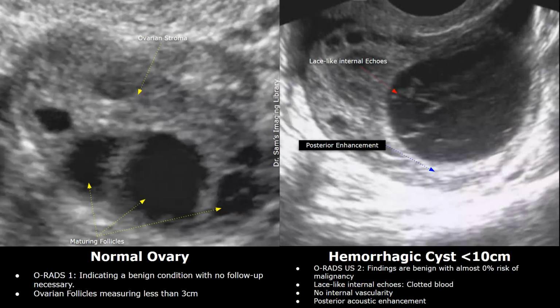A hemorrhagic cyst measuring less than 10 centimeters will fall under O-RADS US 2. A hemorrhagic cyst has lace-like internal echoes. These reticular internal echoes are seen within a hemorrhagic cyst. These are due to clotted blood. No internal vascularity will be seen on color doppler. This cyst will have posterior acoustic enhancement.